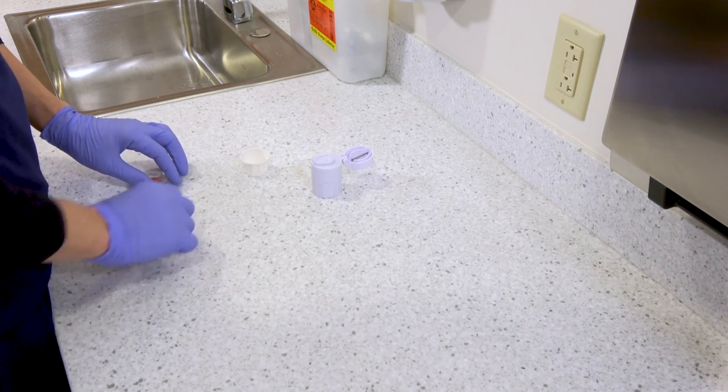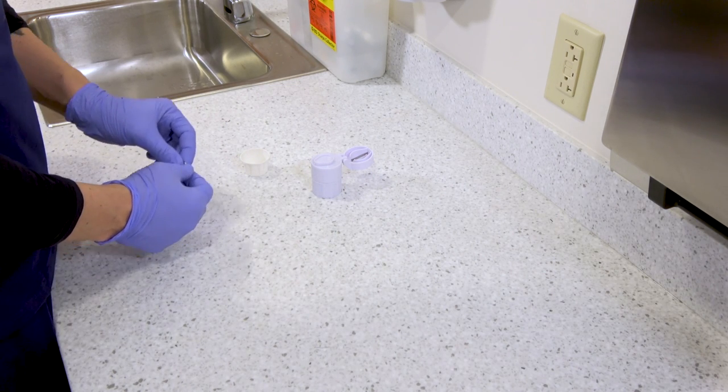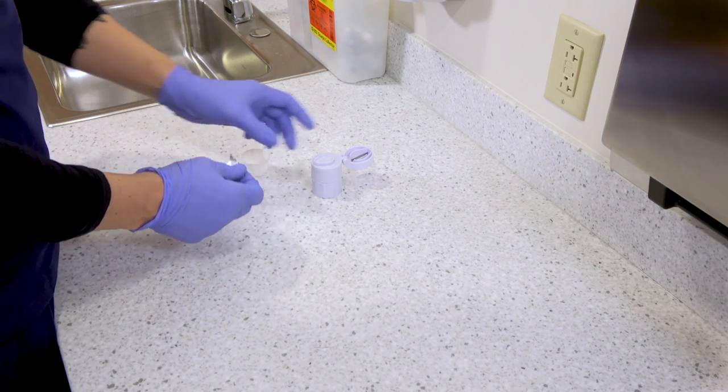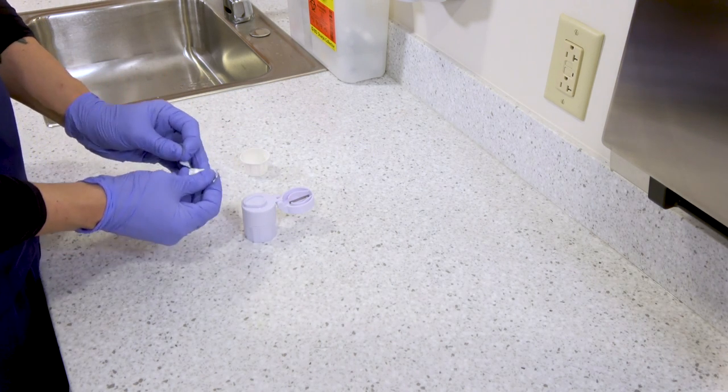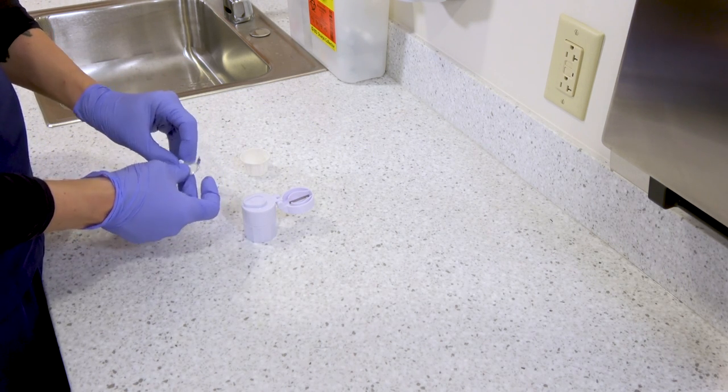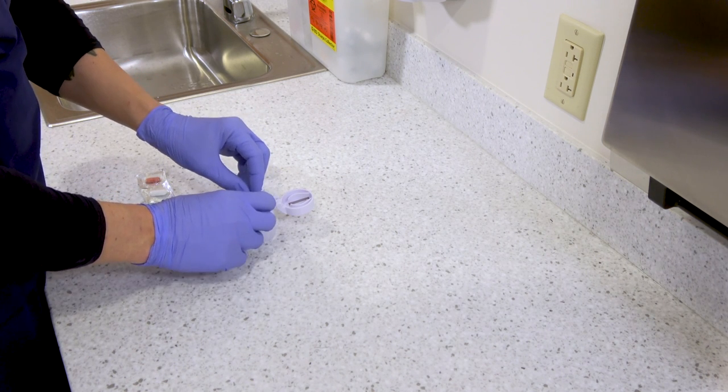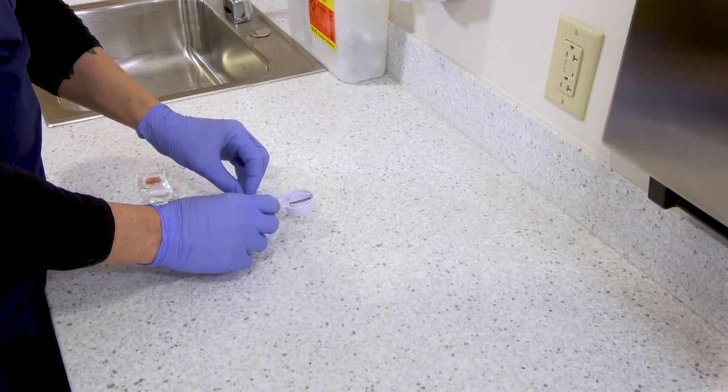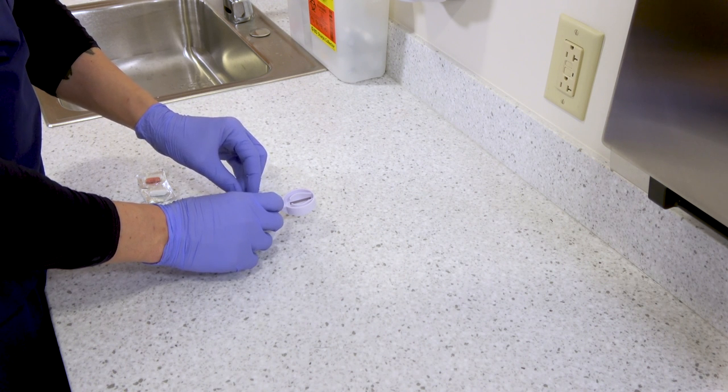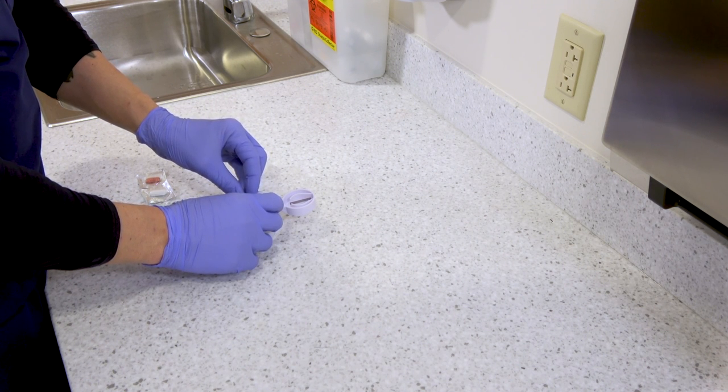If the provider order calls for a half tab, open the pill cutter and remove the pill from its packaging. Carefully place the pill in the cutter and turn it so that the scoring line lines up with the blade. Be careful not to cut your finger.